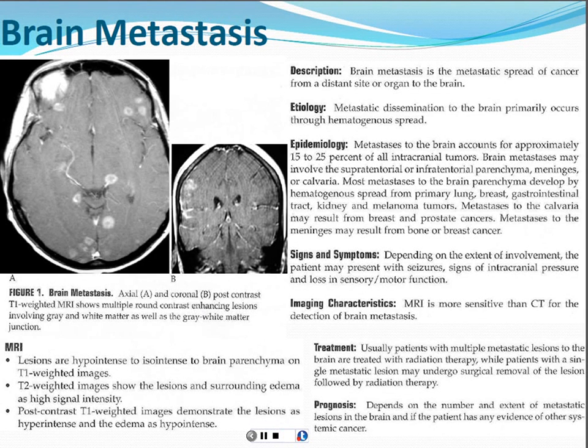And of course, MRI will be really important, not just in detecting whether those lesions get smaller and go away, but sometimes it can be difficult to detect, especially with CT, when you're dealing with post-treatment changes from that kind of a treatment versus a recurrence of tumor. And using the different sequences with MRI can really help you sort out whether you're dealing with something recurrent, whether the patient needs another treatment or not. So you'll definitely be doing a lot of these for brain.